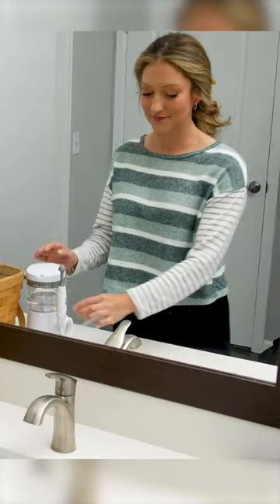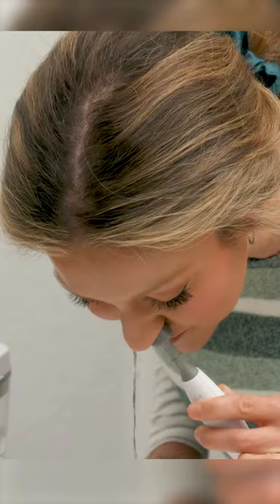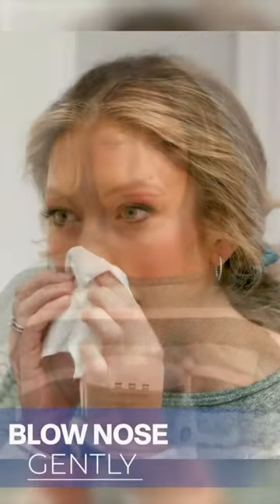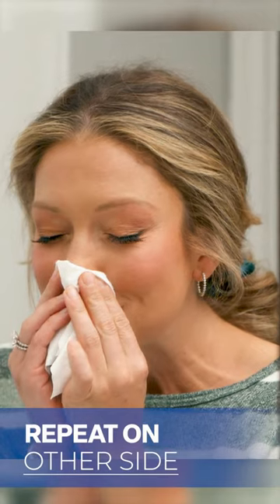Stand over the sink and select your desired flow speed. Place the tip in your nostril and start the flow. The water should drain out the other nostril — in one side and out the other. Gently blow your nose and repeat on the other side.